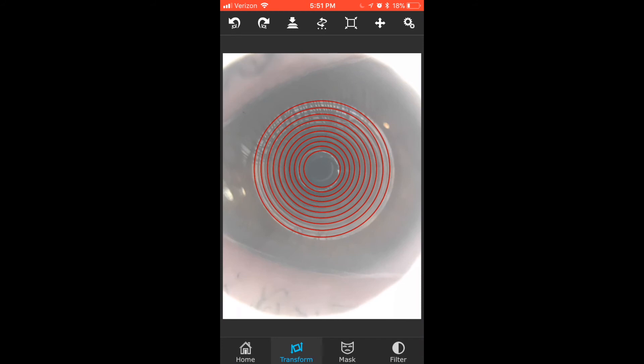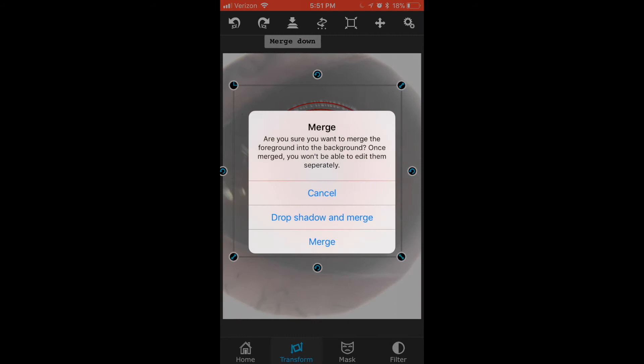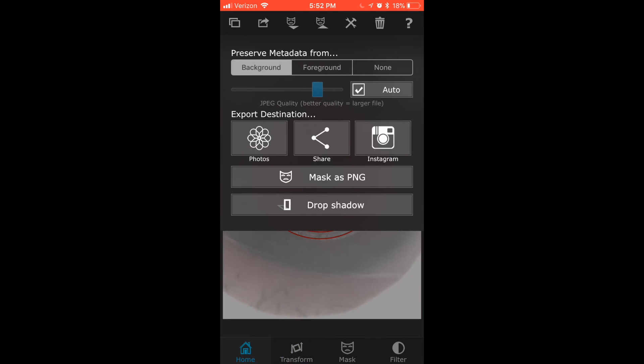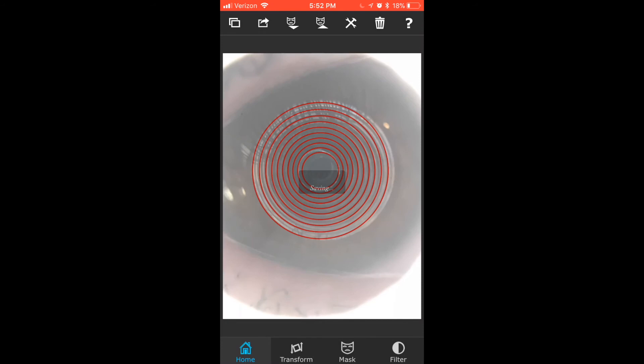Thank you. And you can press the arrow with the two lines to merge the two of them, so they'll become one image. I'm going to press Merge, which is the last thing. And then from there, I'm going to go to the box with the arrow pointing out of it, so I can save this to my photos. So I'm going to press under Export Destination, Photos, and now it saved to my phone. Thank you.